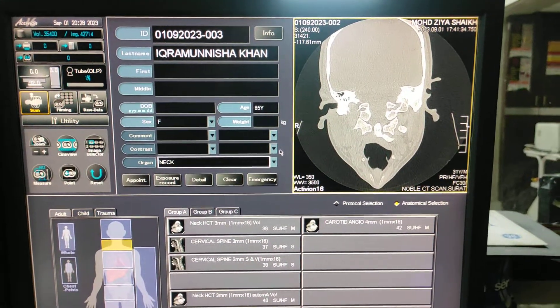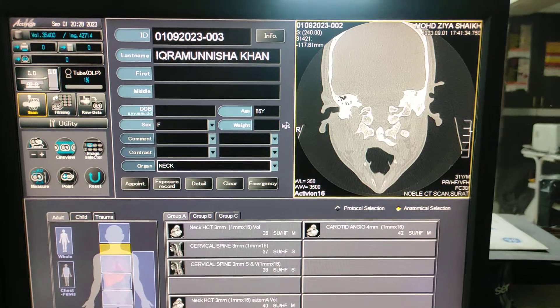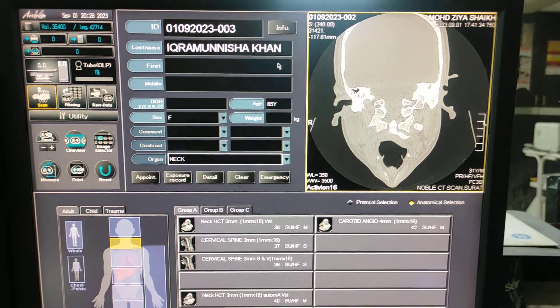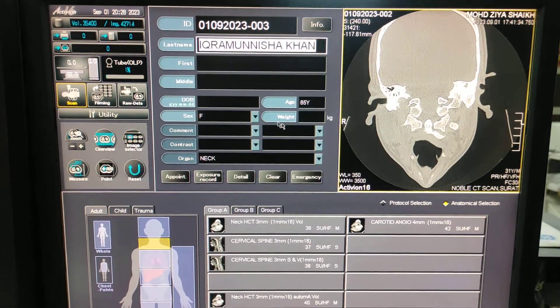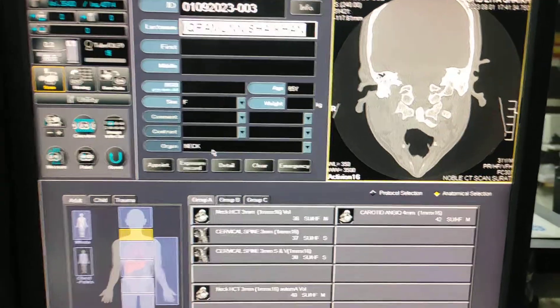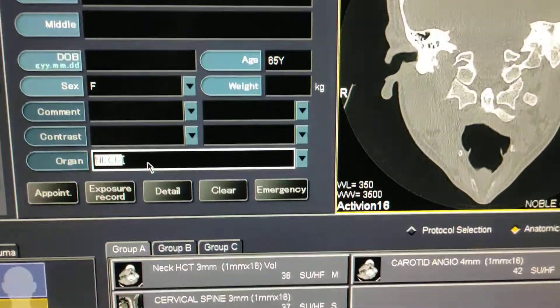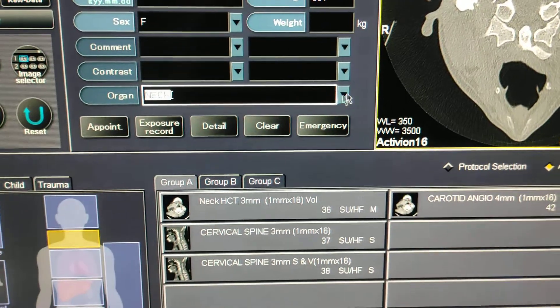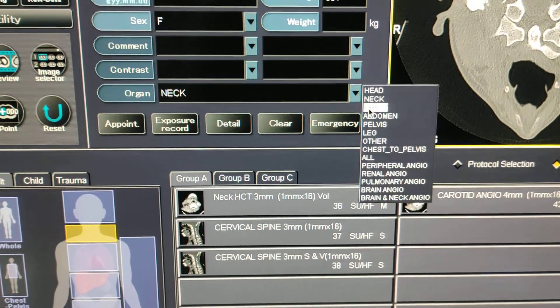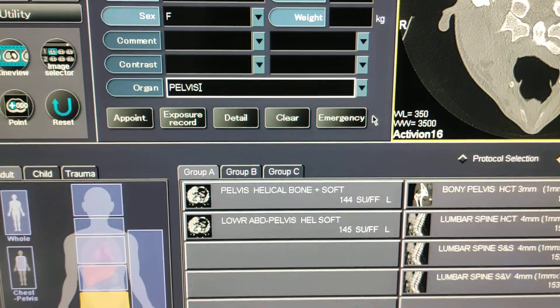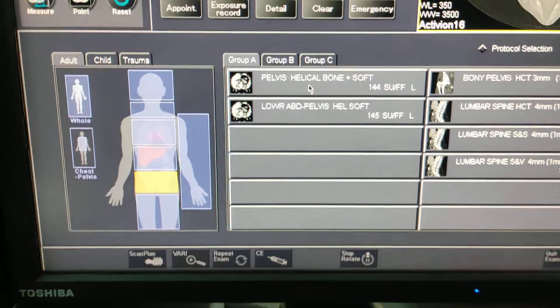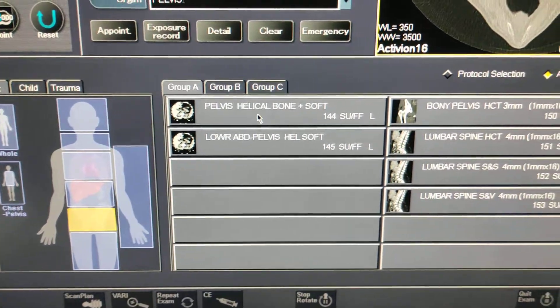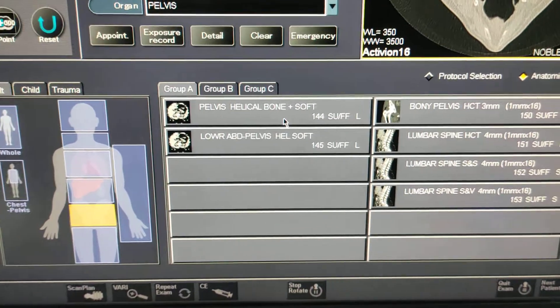First, here on the entry desk, you have to fill in the patient name and data. From the organ selection, you have to select pelvis, and here is the protocol for the pelvis helical scan.